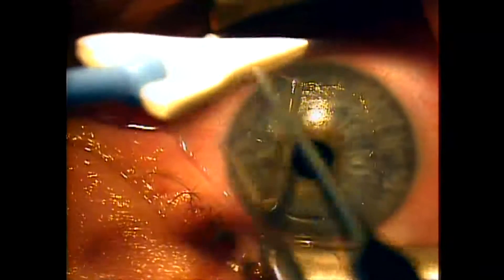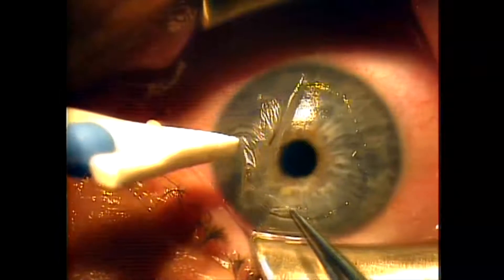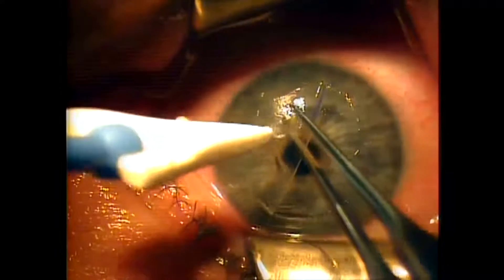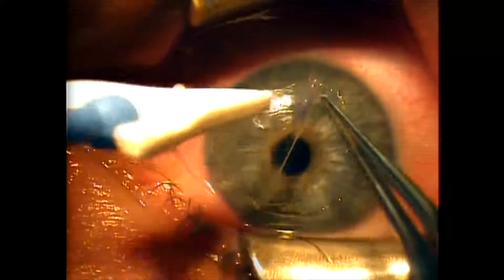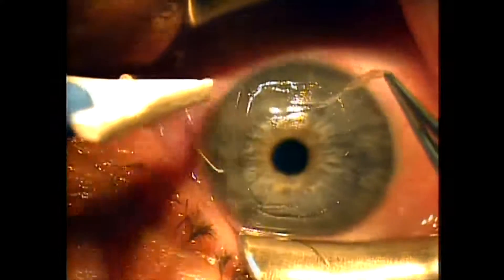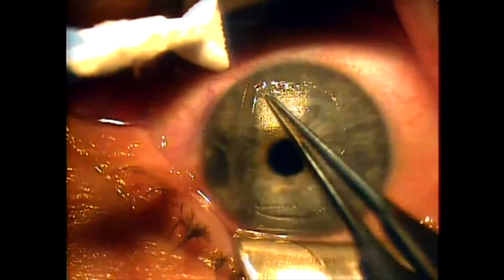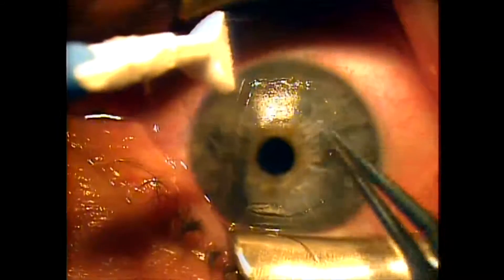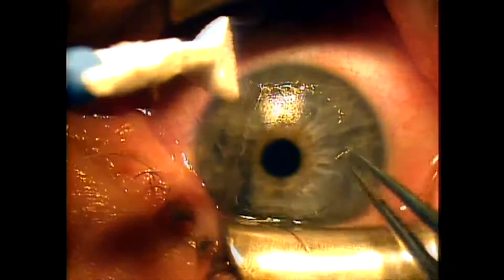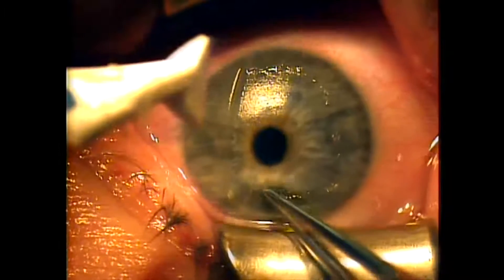These sheets have grown within seven days after this patient's LASIK enhancement. Because we just placed the removed epithelium on the micro sponge, we are able to conserve movement and maintain our eyes visualized on the patient's eye — we don't have to look away. And with these two simple instruments we can remove all the epithelium and fix this nuisance-type problem. I find that epithelium tends to regrow on microkeratome flaps much more often than it would grow on an Intralase or femtosecond laser flap.